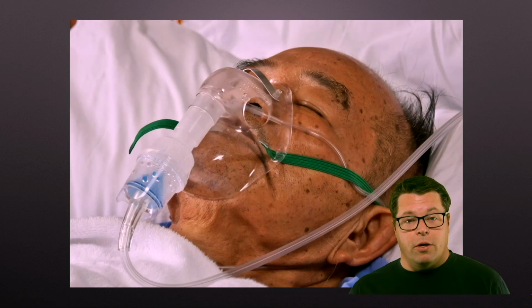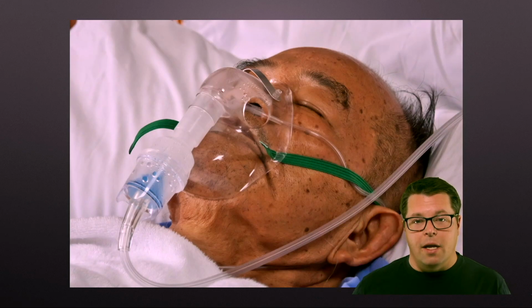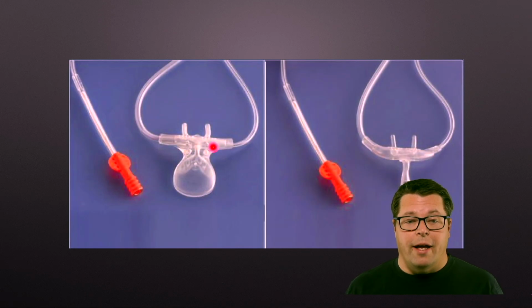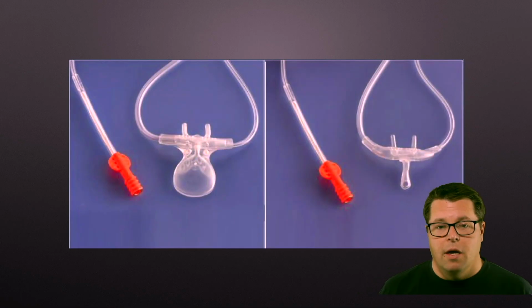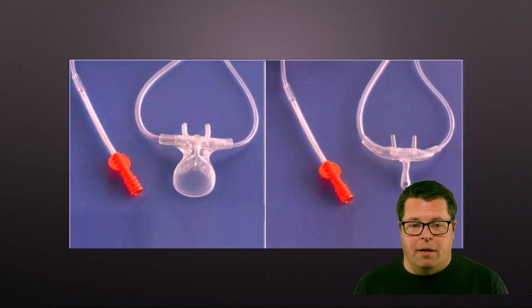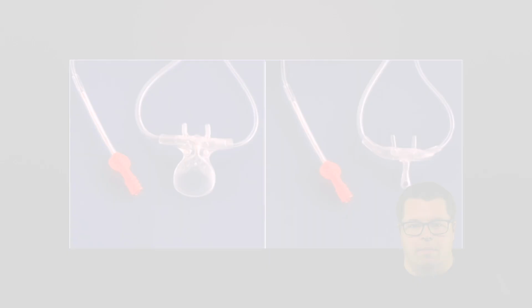To go back to another use here, can you put it on underneath a nebulizer mask so that you can monitor the change in waveform as they get medicine? Yes, you can, because, worth mentioning one more time, you do not actually oxygenate through these little holes. This thing collects CO2. These little guys collect CO2. The oxygen actually comes out here and sits outside the patient's face, and that's based on both the pediatric and the adult size. So you can certainly use them. They're great tools, and they're excellent at detecting apnea, but you have to watch out because you may not be able to oxygenate as effectively, and you won't be able to do apneic oxygenation through these guys.